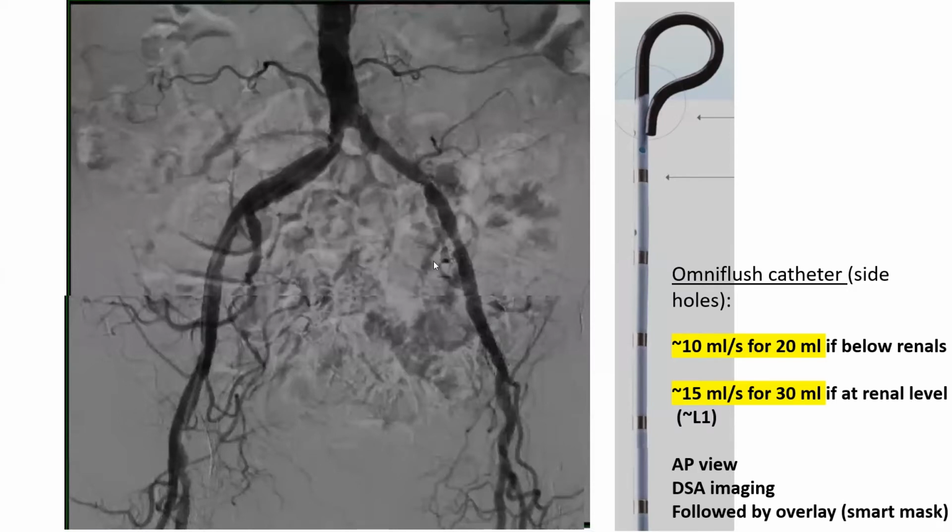And the beauty of that overlay is that you can adjust the intensity. You can loosen the intensity so that you see your gear, your wire and catheter that you're actively advancing, or you can intensify it if you want to see more where the branches are in that subtraction angiography.